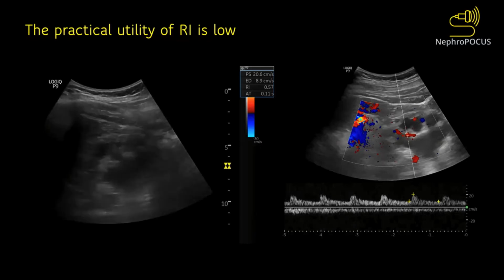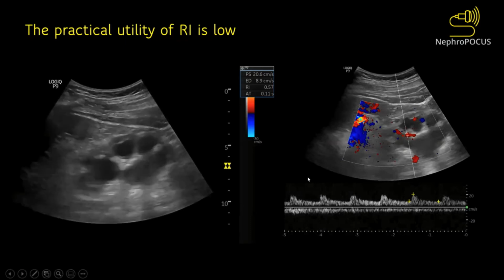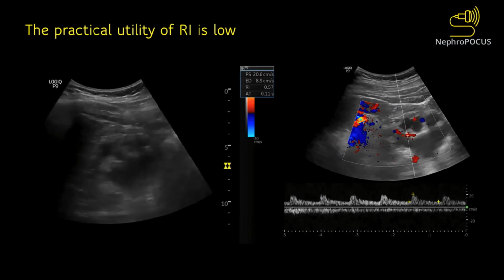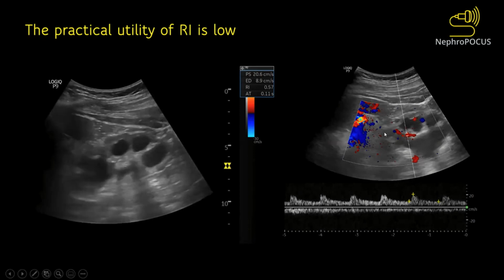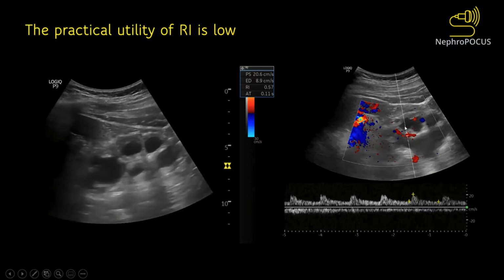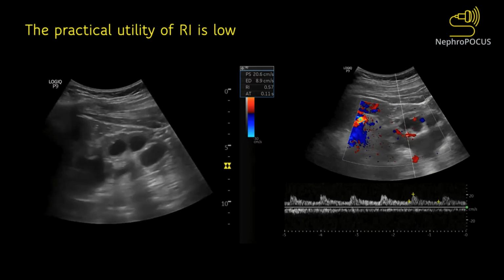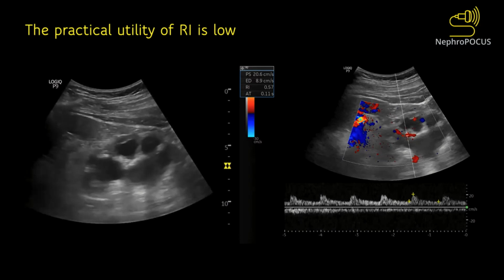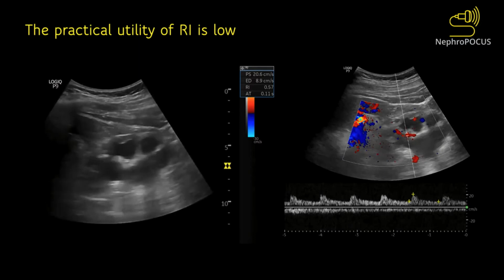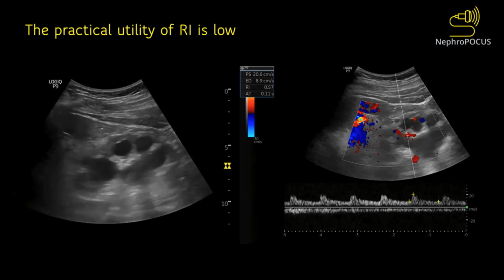I said resistive index increases in obstructive uropathy, right? So this is a recent patient I saw who had hydronephrosis. Measured the resistive index, see, it's 0.57. It's much lower than 0.7. You can argue that you did not really measure it in an interlobar vessel. You probably measured it in a segmental vessel. I agree, but still, it's intrarenal, and it's surrounding the hydronephrosis. So there must be some kind of pressure effect if you believe that pressure effect is leading to increased RI. So it's not always there. I've seen several cases, not just this one, that it's not always elevated in obstructive nephropathy. But anyways, obstructive uropathy is the least of our concerns when it comes to RI.